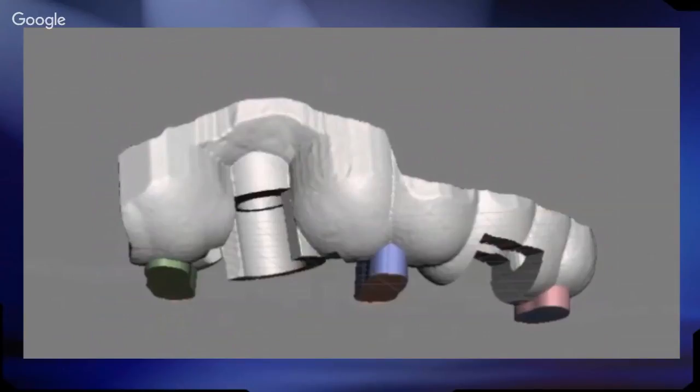With the Xiav, you have control over that dimension. So you can print however many layers you want over cured, and we found that we can print 10 layers over cured, and that's enough. So you only need to print or lift the model or the guide 1mm or more off of the build platform, and you'll still get an accurate printing without any over curing on the detailed areas that you need, such as the intaglio surface of the guide.